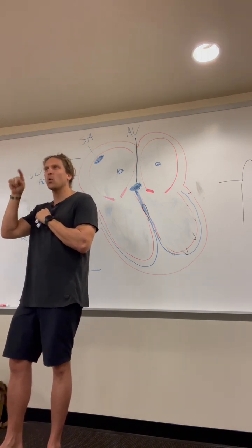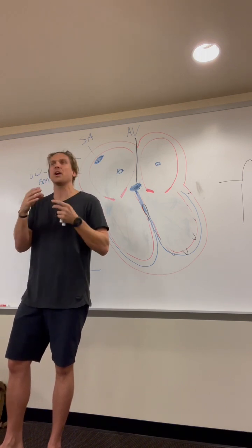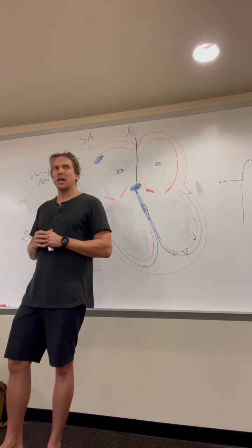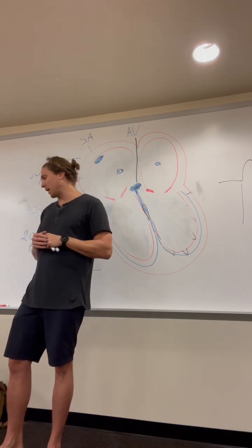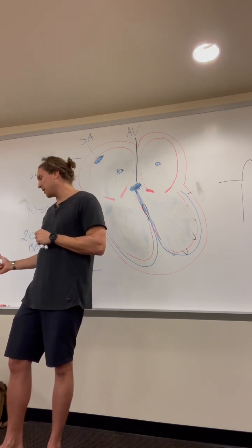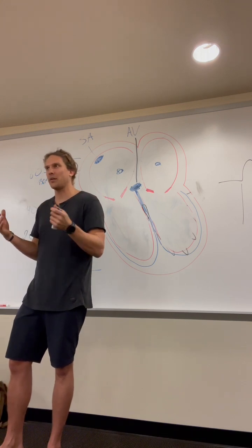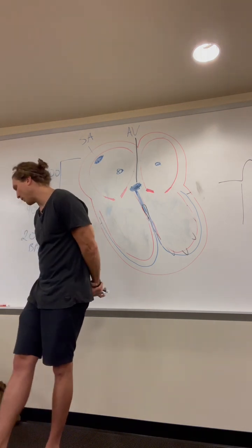That line, there is some quivering there, okay? People move, people breathe, it's going to cause what's called artifact, and that happens. Don't read too much into those little squiggles. Those aren't anything, that's just the patient moving. And again, you can just remember that this specific rhythm strip is her bradycardia example for the test. Don't look into those little extra quivers.